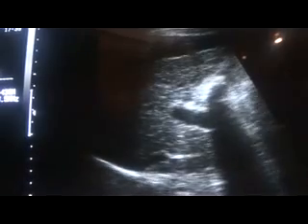This is a 58-year-old female who has reported with menorrhagia, again bleeding per vagina. You see her liver is cirrhotic. She is unaware of the fact. There are multiple tiny calculi within the lumen of the gallbladder, and the portal vein is seen at its right angle. It's not dilated. This is the gallbladder, and these are the calculi, giving posterior shadow from here to here.